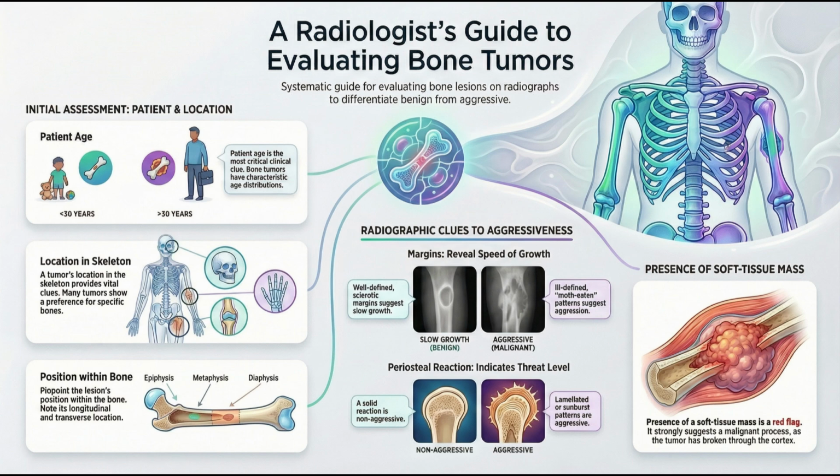Bone-RADS is the systematic culmination of all this decoding. It's a risk stratification tool that assigns points based on how many aggressive features you've found. It quantifies the risk to guide management. It removes the guesswork. I notice that not all 7 features are weighted equally, so which findings trigger the most severe scoring? The system assigns the highest point values to the features that indicate rapid, aggressive growth.